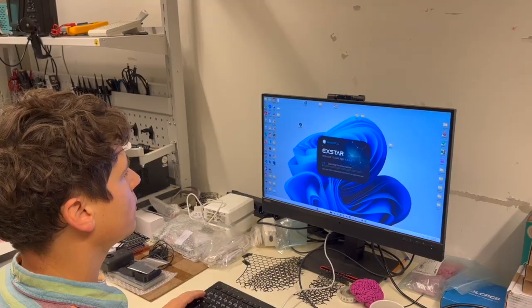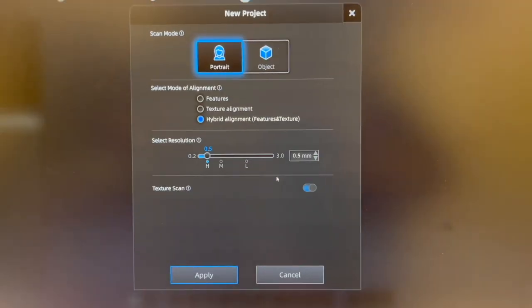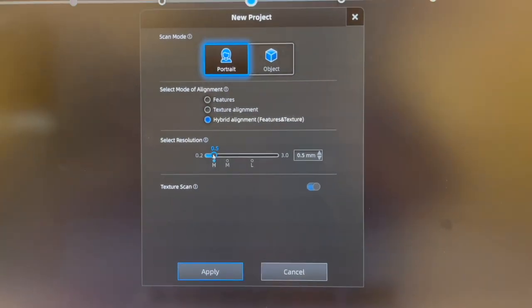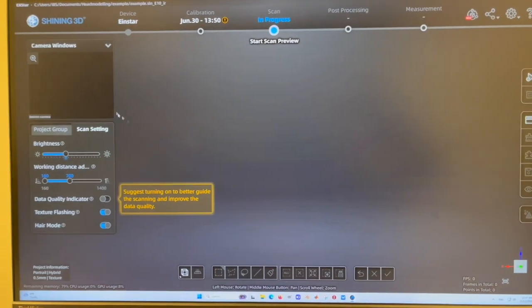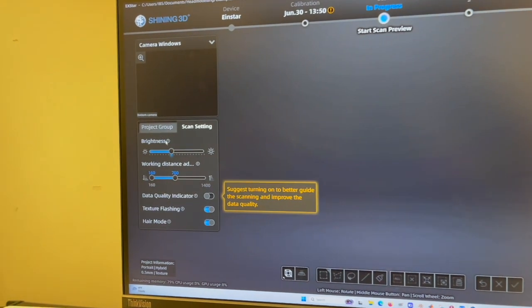I start the extra recording software, start a new project, choose portrait and hybrid alignment mode. Regarding the resolution, we made good experiences with setting it to 0.5 mm, which is a good balance between resolution and processing time. And then we come to the settings, which we can also change during scanning.